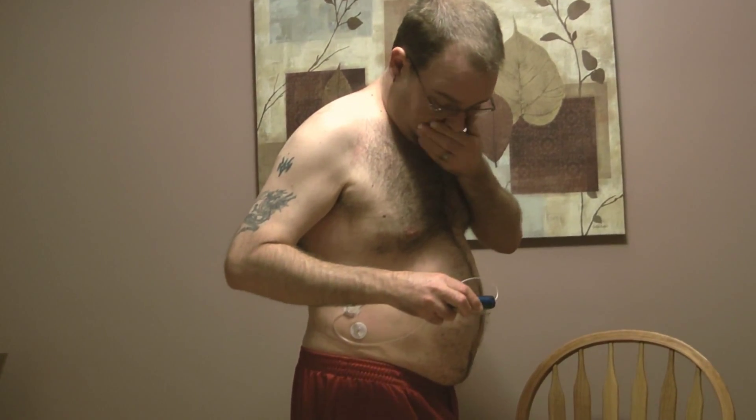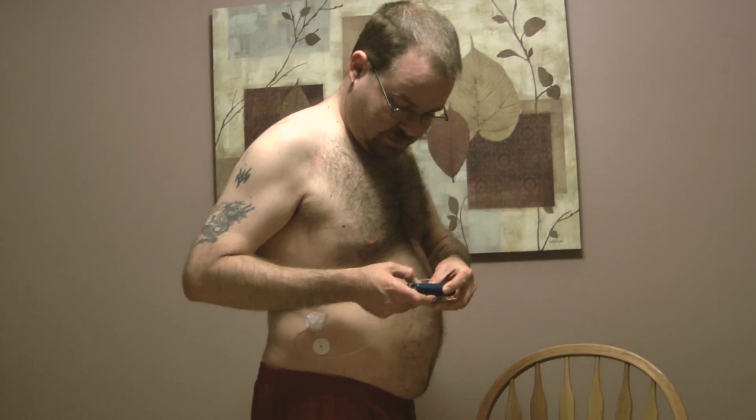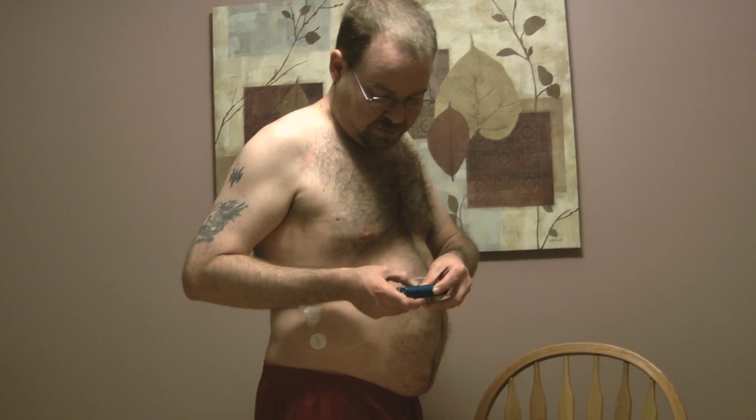I'm going to hold the back of the needle and cannula assembly, peel off the sticky tape, and insert the needle into my body and smooth down the tape — just like that. Didn't feel a thing. Now I've connected the set to the body, and I'll just give myself a quick check to make sure everything's connected properly. Everything's connected correctly and the pump is done.